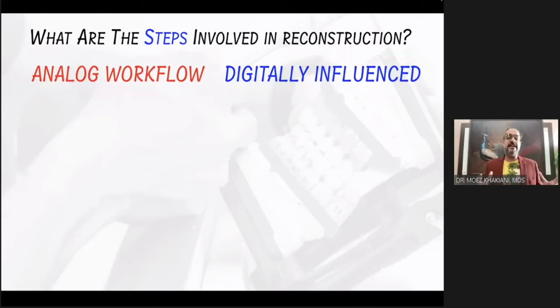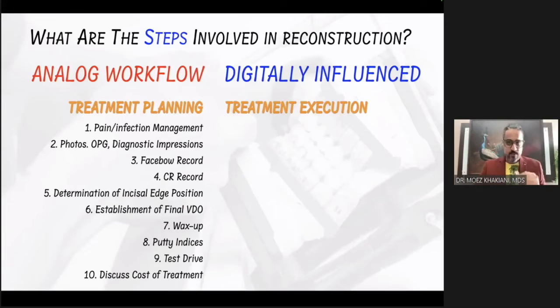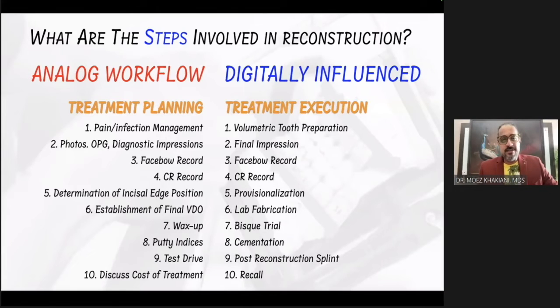And here I am specifically talking about digitalization from one of the most complex topics of fixed prosthetic dentistry, which is a tooth-supported full mouth reconstruction. To add perspective to this, I will first give you the steps. Remember, whenever we do a full mouth reconstruction, it's not like the patient comes, sits, we cut the teeth, and put the crowns. No. There has to be first the planning phase, and then subsequently comes the actual execution phase. So I'm going to list 10 steps that I follow in a sequence with respect to my treatment planning, 10 steps with respect to my treatment execution.